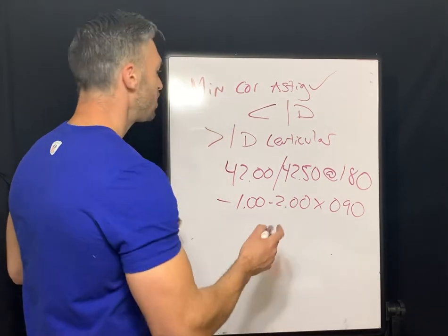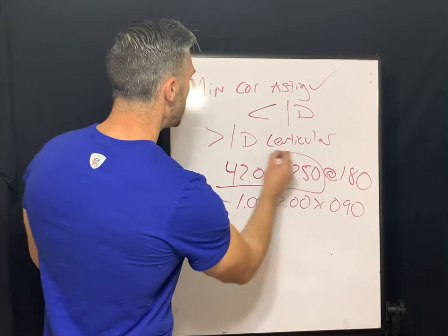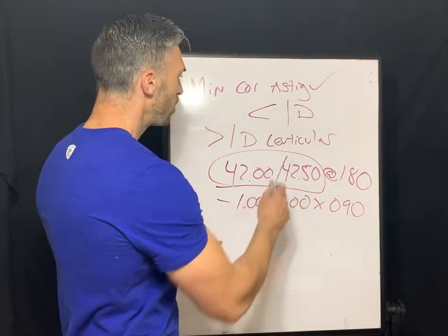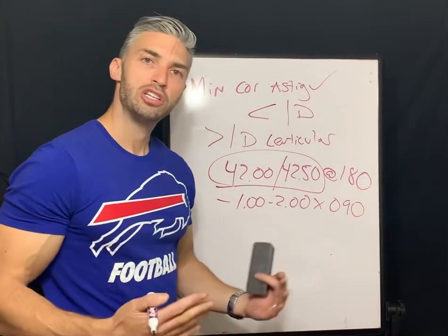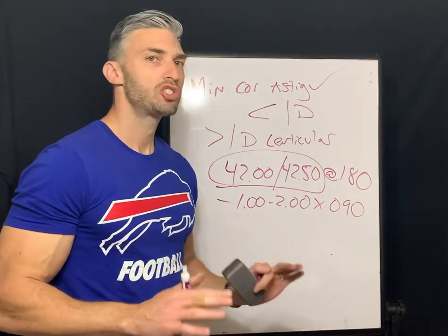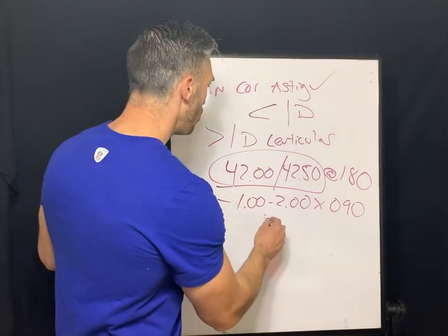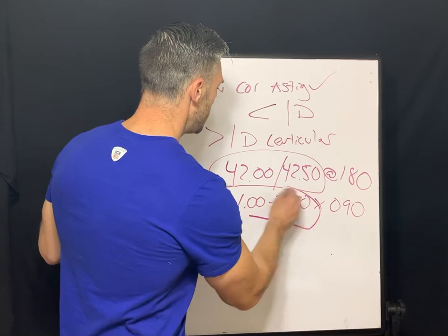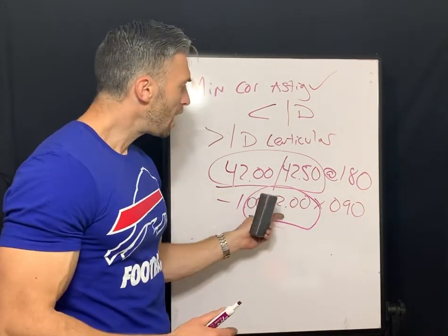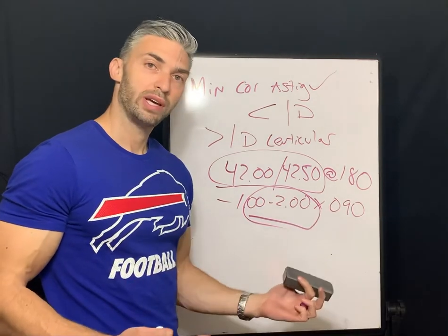What we have here, first off, kind of like what we were doing, identify how much corneal astigmatism is present. 42 to 42.50, those are our two major meridians. There's just a half a diopter of difference, so not much corneal astigmatism. What we want to look at here, our key point to this example, is the manifest refraction. It's showing 2 diopters of astigmatism. Well, that 2 diopters isn't coming from the cornea, right?